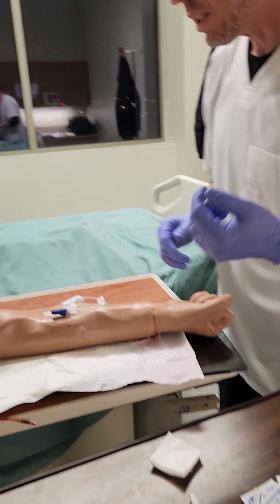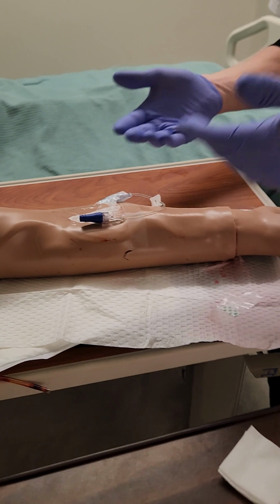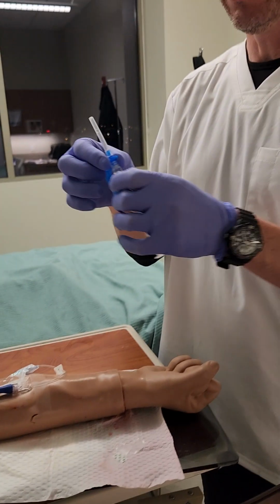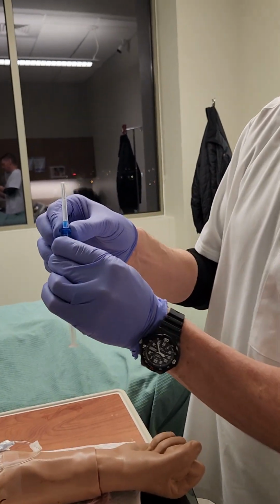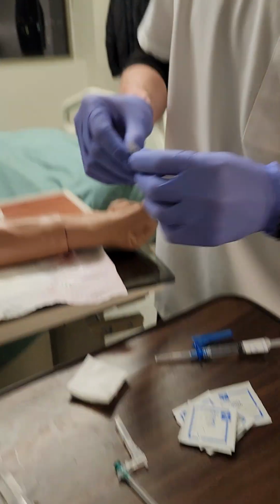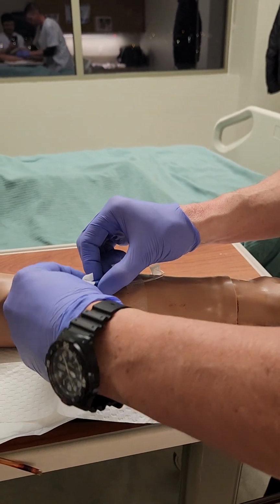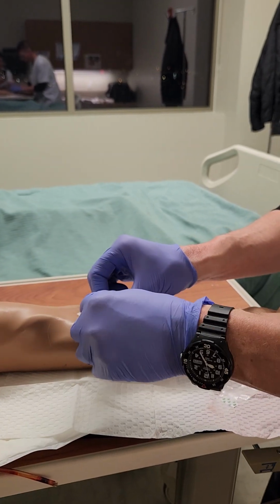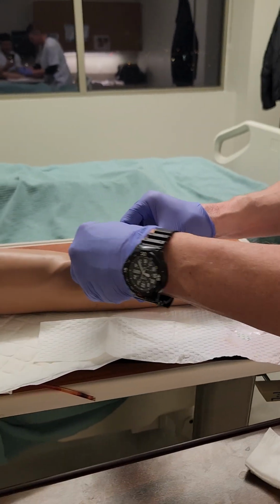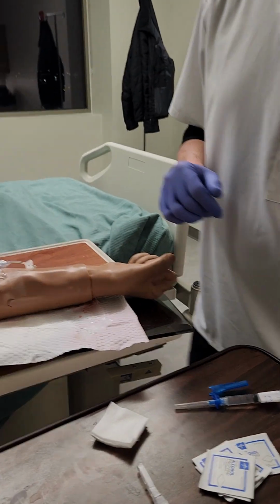So it looks like your IV site looks good. It doesn't seem to have any problems. Is it causing you any pain in this area? All right, just wanted to make sure. I'm also going to take, let's see, oh wait, before I take that off, I want to clean this right here. I'll make sure that is nice and sterile. All right, throw that away, give that time to dry.